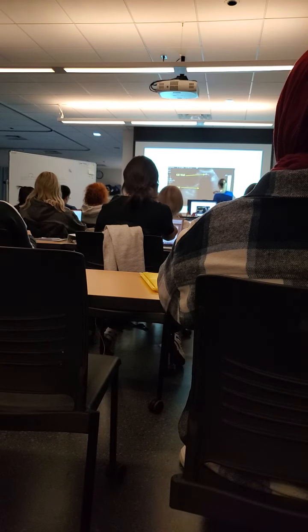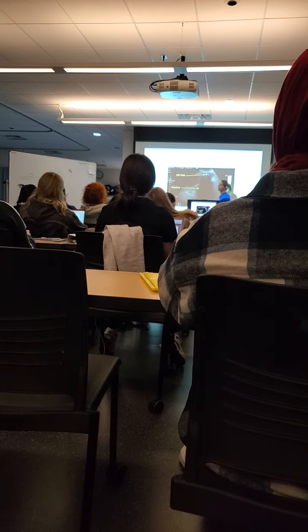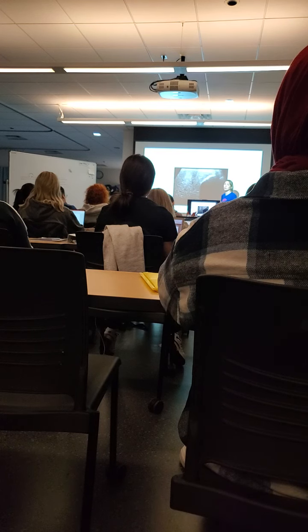So here's our porcelain gallbladder. I don't believe that this is the wall, but here we have the entire echogenicity, so we're not seeing any change between the wall and the echo, just echogenicity and then significant shadowing. Same thing here, so no real wall. The wall is calcified, so all we're seeing is that calcified wall and just a bunch of shadow.